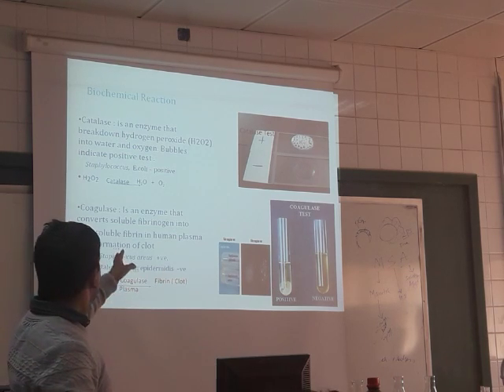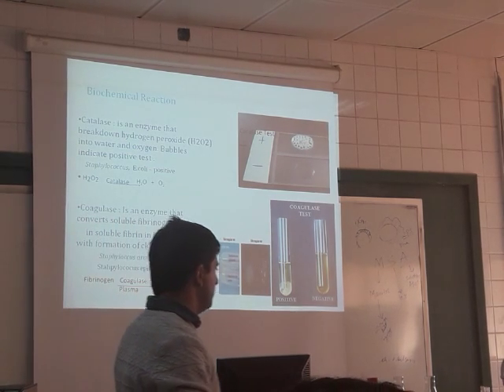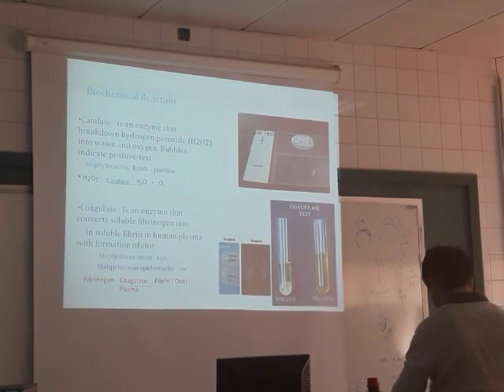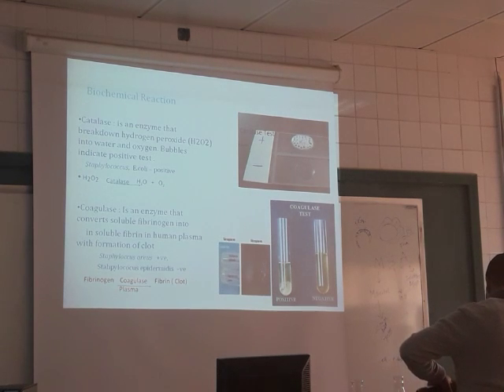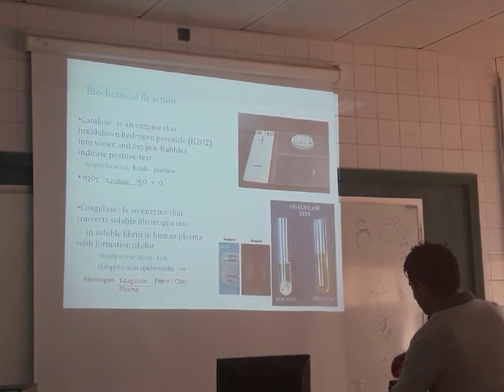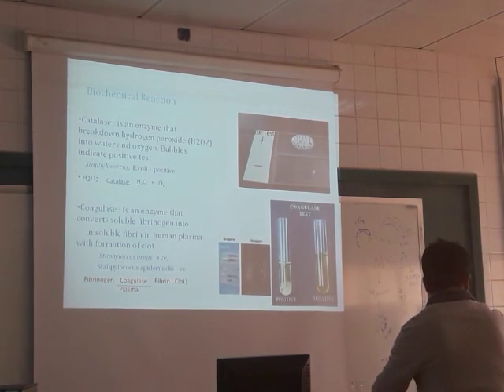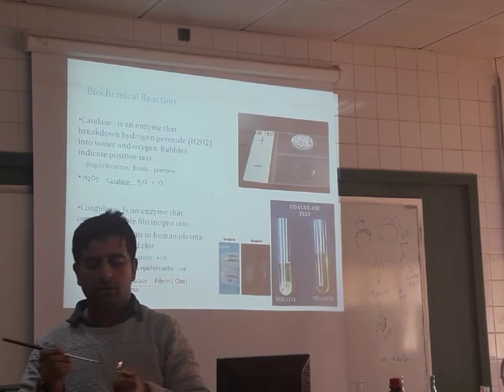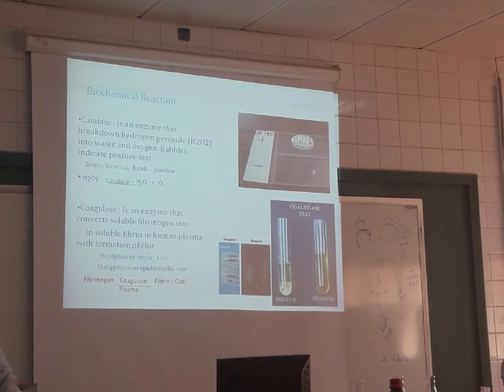Blood agar, MacConkey, and this. Now these are the enzyme tests. What is the first test here? The first enzyme test is called catalase.